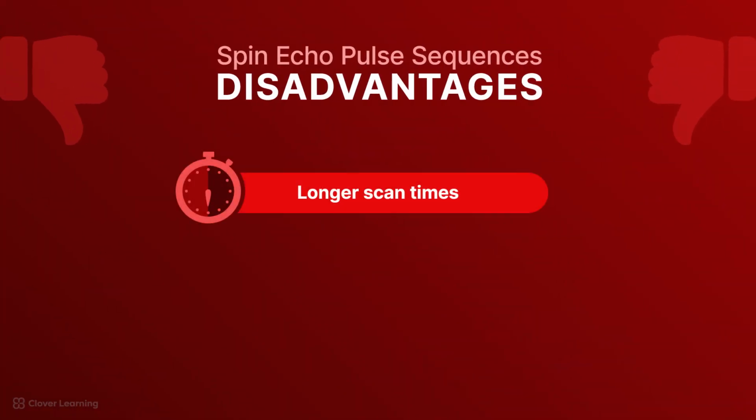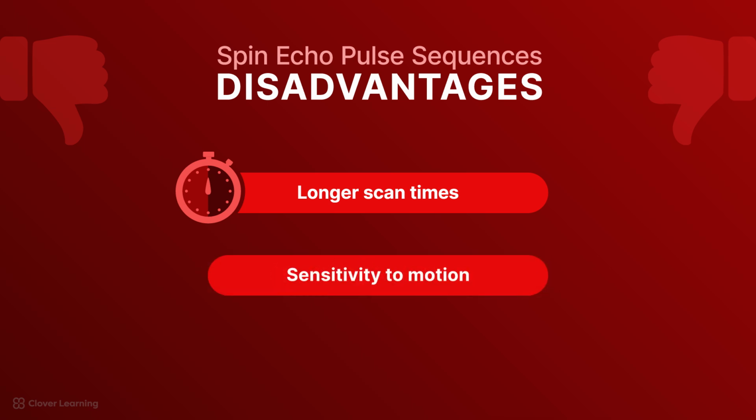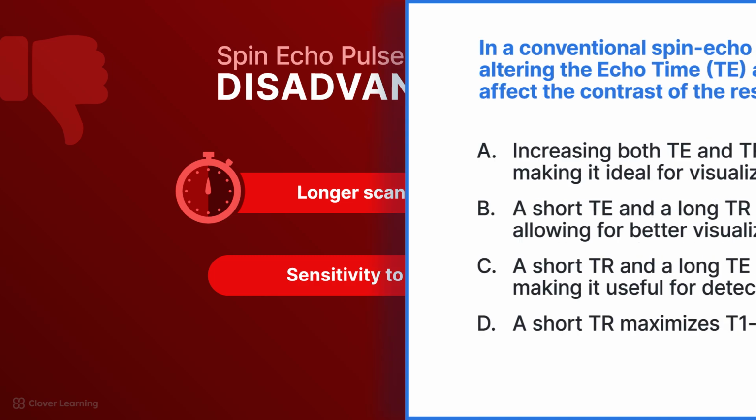Disadvantages: longer scan times. The process of acquiring multiple echoes for image formation results in longer scan times compared to other sequences, which can be uncomfortable for patients. Sensitivity to motion. Patient or physiological motion during the scan can affect the quality of the images.